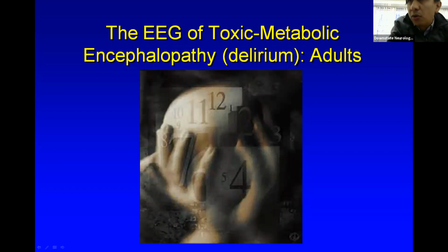Dr. Kaplan, there's another question also coming from the chat. It's from one of our residents. So it comes like this. Frequently, when we have a report of triphasic waves, we do not treat aggressively. But with such high mortality in triphasic waves, should we try to treat triphasic waves more aggressively? And has the mortality been adjusted to the underlying cause? Or is the mortality just a reflection of the severity of the underlying problem that caused triphasic waves?